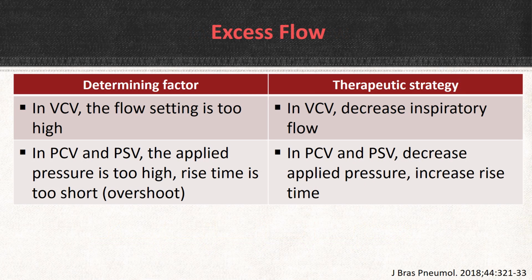Excess flow. In volume control ventilation, the flow setting is too high, or in pressure control or pressure support ventilation, the applied pressure is too high. So, we have to reduce this flow, or in pressure control or pressure support, we have to reduce the peak pressure or pressure support setting.